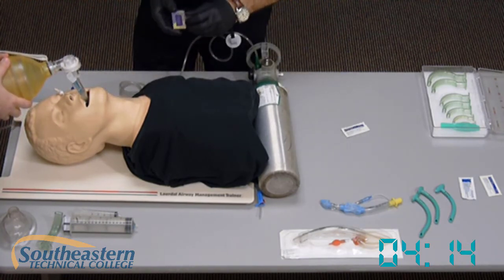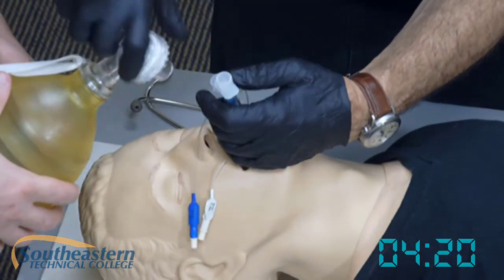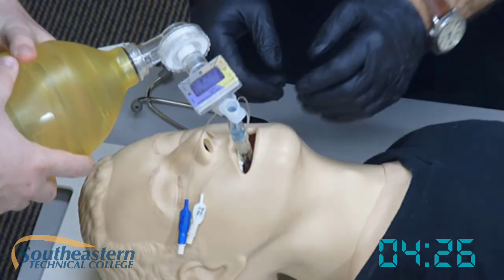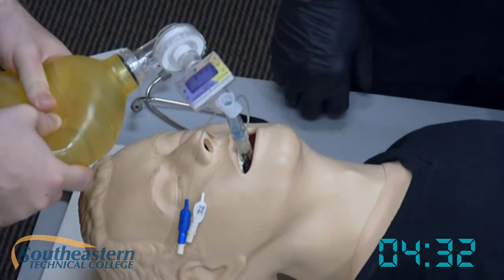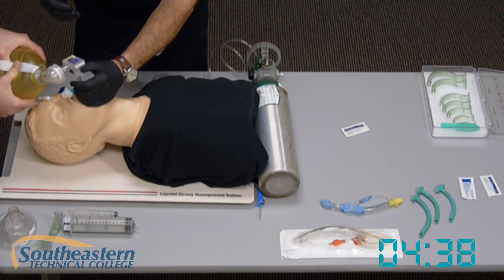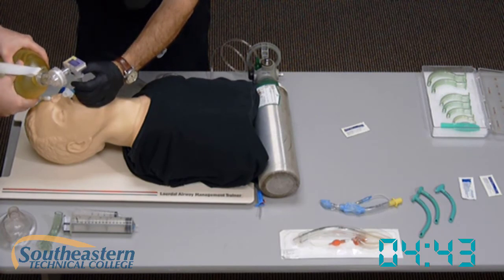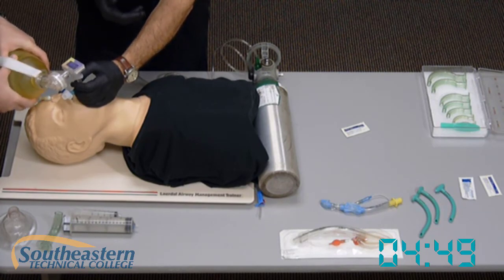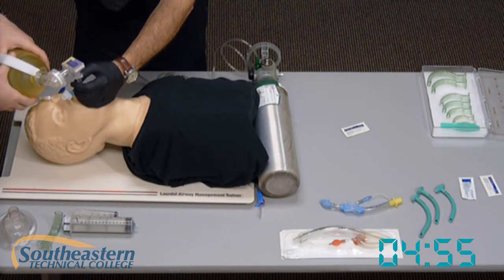I will also verify placement using capnography — colorimetric, starting with purple. I'll apply it, ventilate, and I should see a change in the colorimetric device from purple to yellow. I know that I'm ventilating appropriately because I'm getting equal bilateral chest rise of adequate depth. We'll continue ventilating our patient — we've verified using a couple of different methods, colorimetric and capnometry, that the tube is in the right place — and keep evaluating our patient.